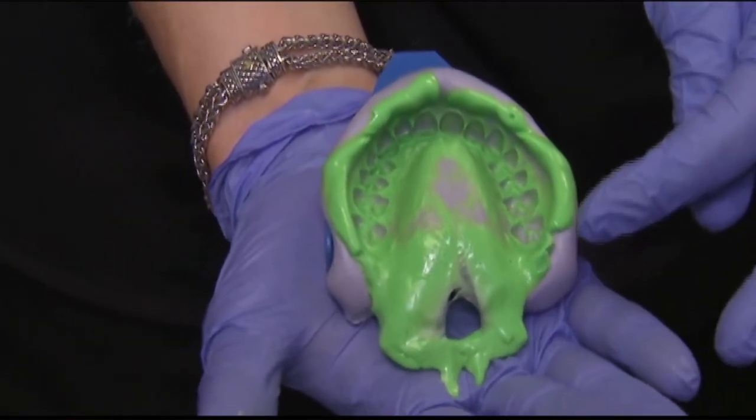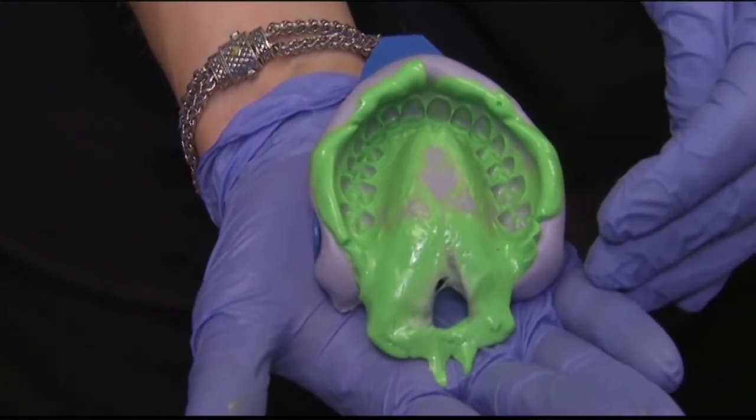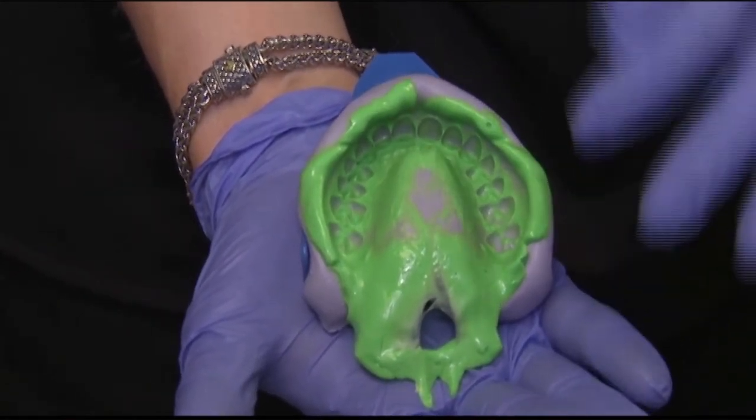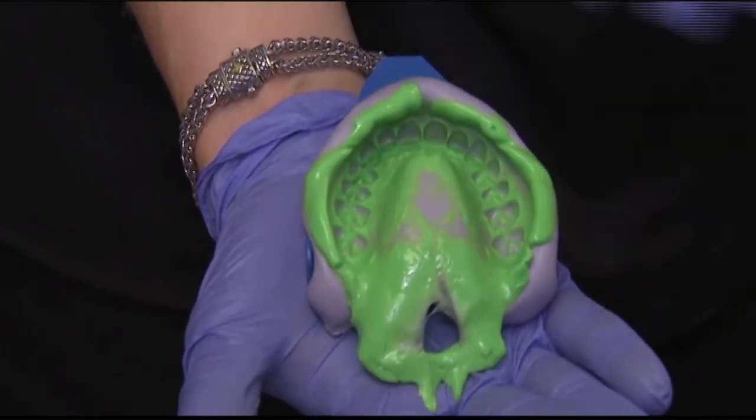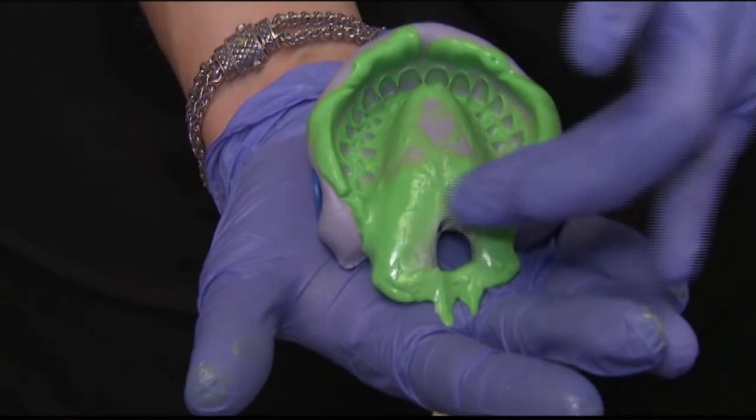So I love this. Great impression material. Yes, got a lot. I almost got our lungs in that one. But I'm going to get it. But the great thing about putty is it doesn't run. It doesn't go down their throat. Yes, I'm adding the light body, but I can tell you that patients really don't mind it.